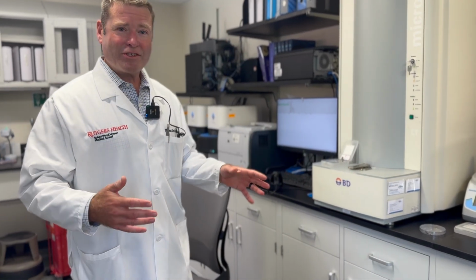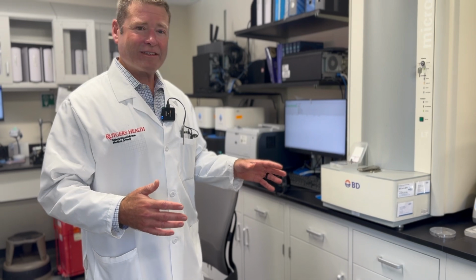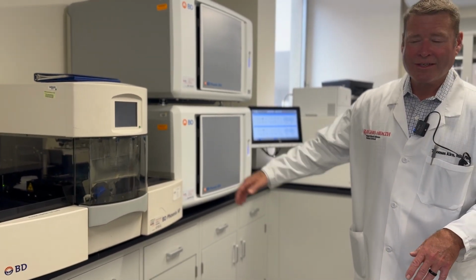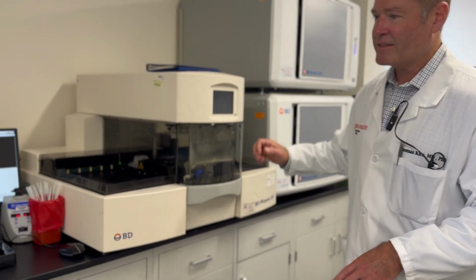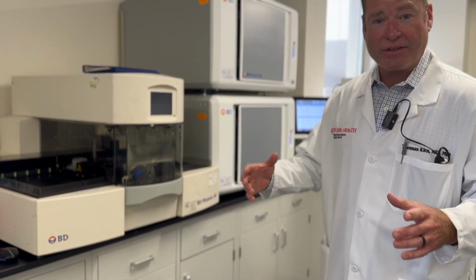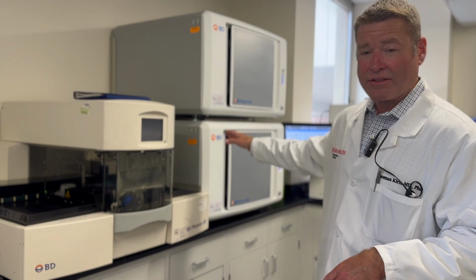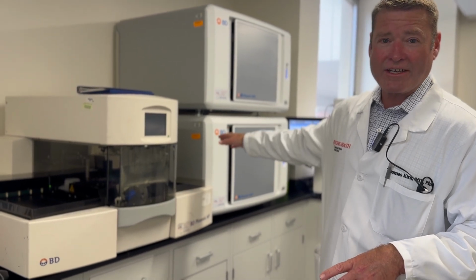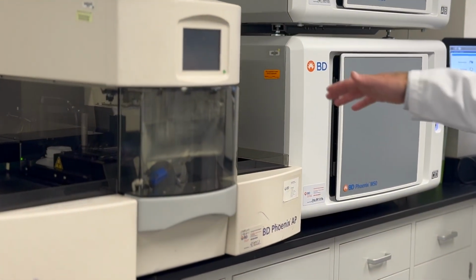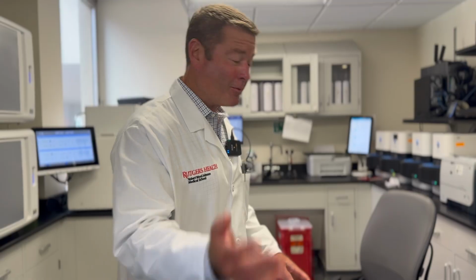If the identification indicates that susceptibility testing is required, then that's done over here on this instrument, which is our automated susceptibility testing instrument. The way that this instrument works is the organism is put into a cartridge. The cartridge has wells in it that have different antibiotics in them, and this will incubate those cartridges for a set amount of time and look for growth or no growth in those wells to determine if the organism is susceptible or resistant to the antibiotic that we're testing. Come on over here, let's look at this.